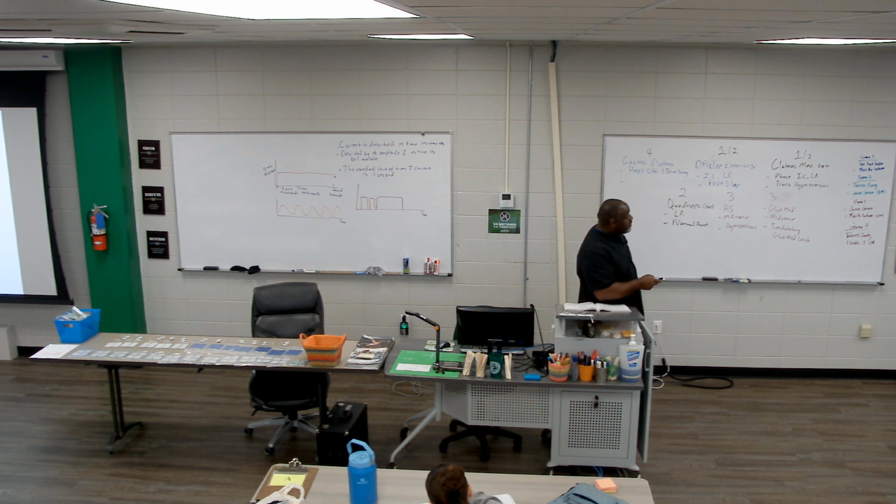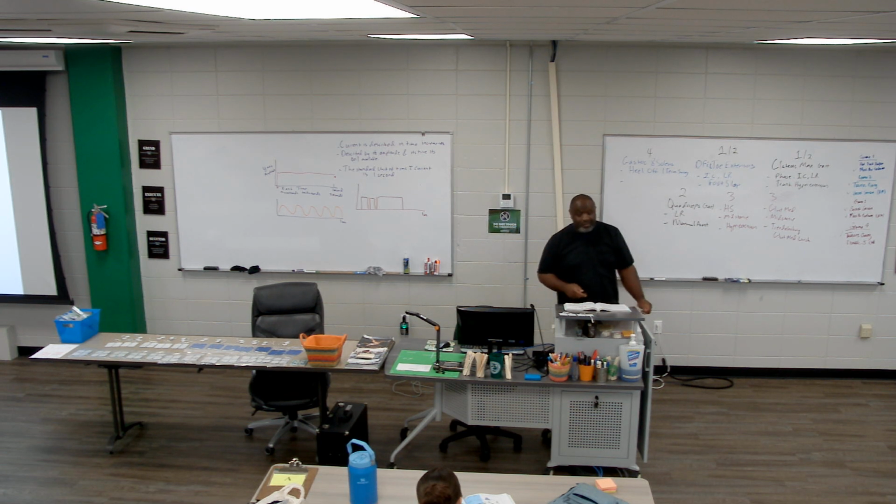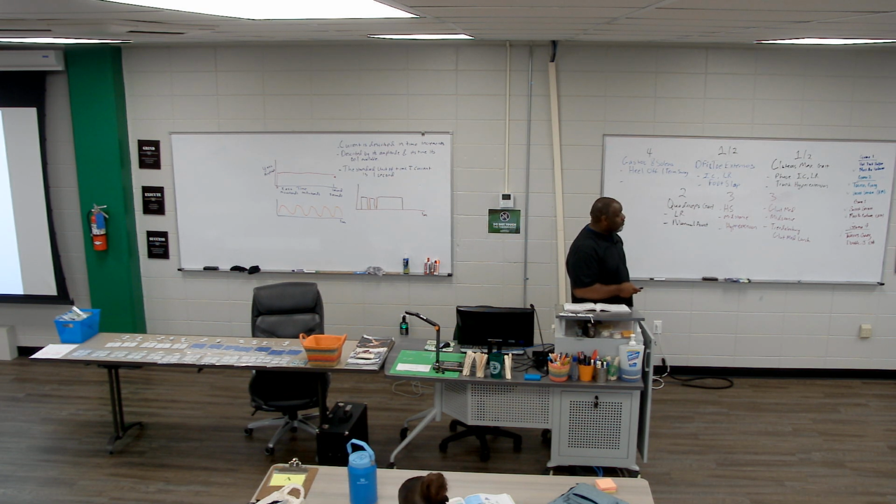The black line here is the isoelectric line. It could also be below it. If this was underneath it, it could be that. So it could be positive or negative. It doesn't always have to be positive above the isoelectric line. It could be negative, but it's only going to have one position, either above or below the isoelectric line.